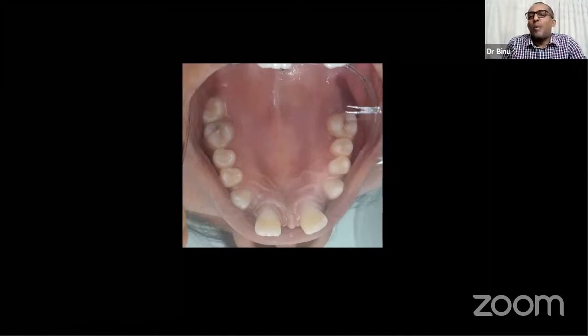What do you do to avoid fogging? You can do many things. You can buy an anti-fog mirror, which is like 4,000 rupees. What I do in my clinic for my mirrors is the 200, 300 rupee Amazon stuff, which is like steel ones, not mirror, steel. It scratches, but only if you're very careless with it.